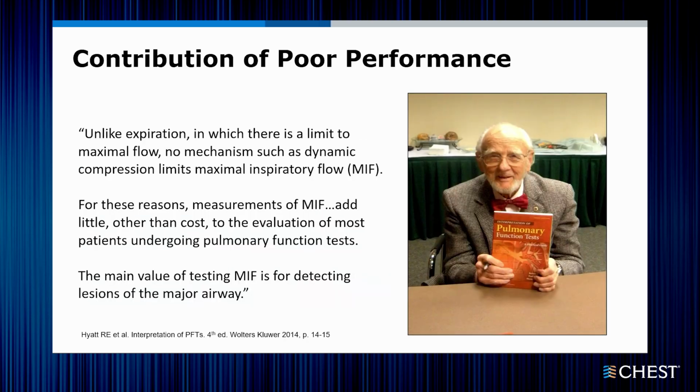Oh, I'm sorry, before we go there, let's talk a little bit about performance. And I need to share with you a little bit of a dirty secret about our lab. So Bob Hyatt is largely recognized as the inventor of the flow volume loop, so it's really hard to argue with things that he's put into place in the lab.